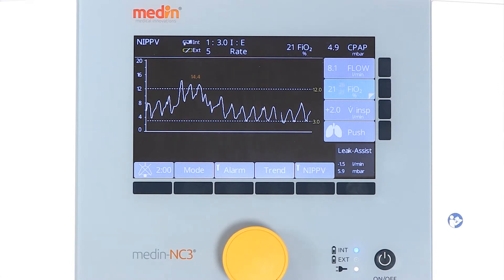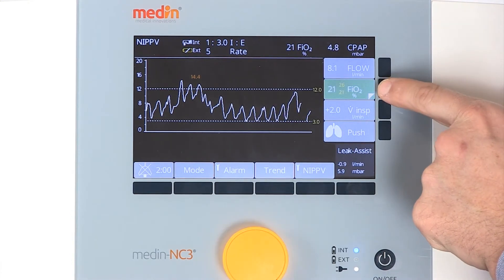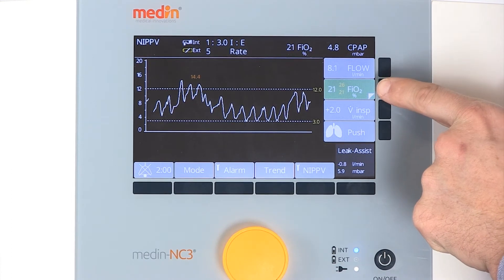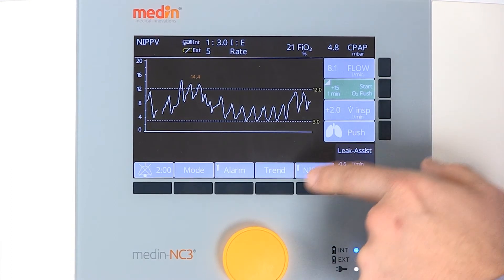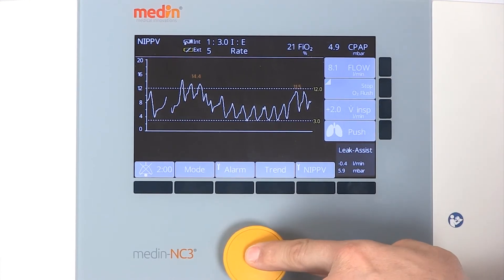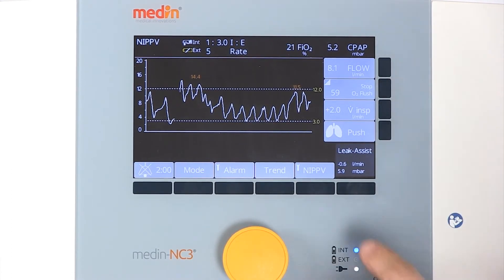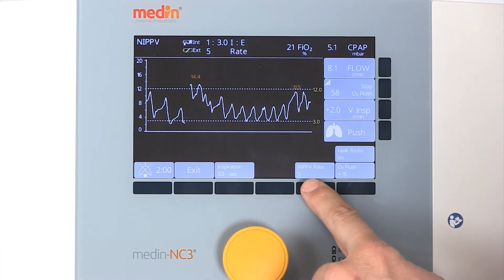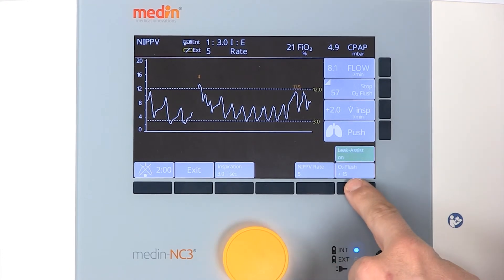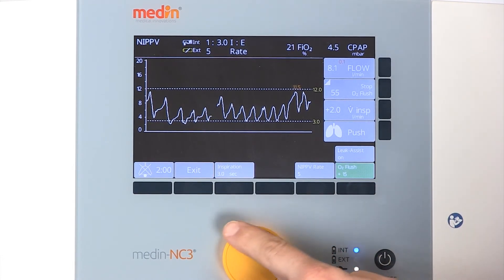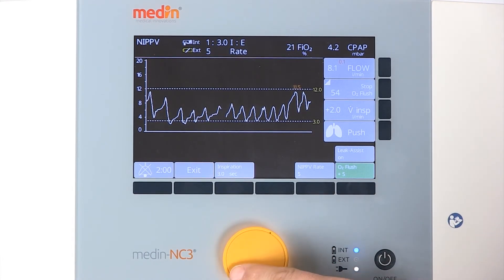Oxygen and an oxygen flush can be set manually. The range of oxygen for the oxygen flush can be set between plus 5, plus 10, or plus 15% above the current FiO2.